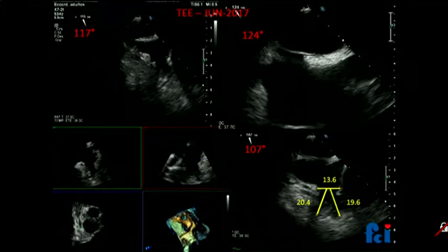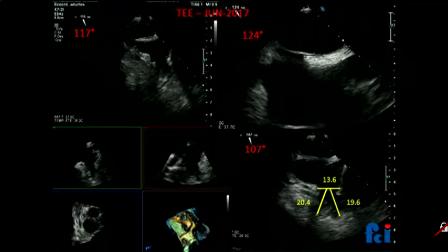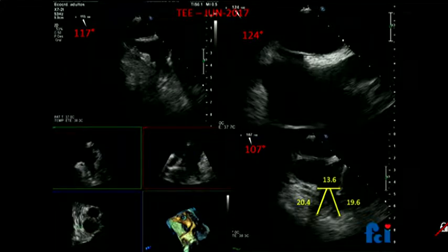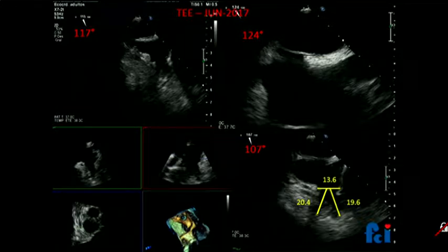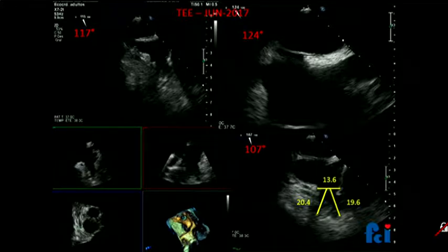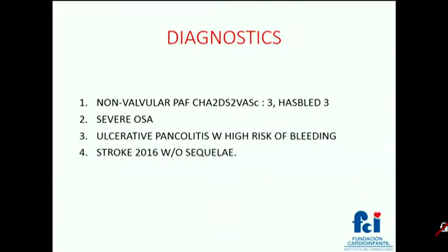These are the measurements: 117 and 124. We are going to do intracardiac ultrasound which we will need for a certain view. This is the appendage with different measurements, two cavities, and different measurements. All these measurements will be re-measured during the procedure.